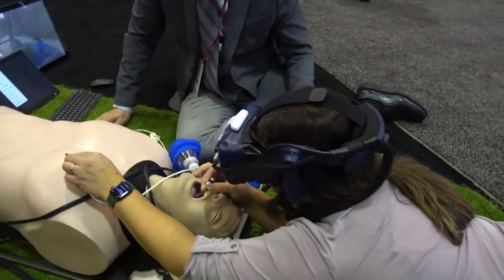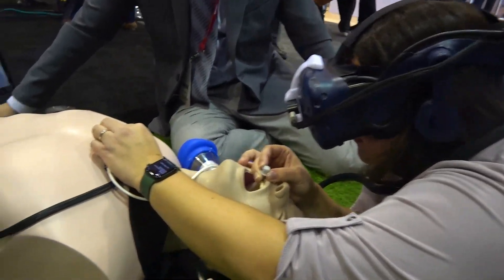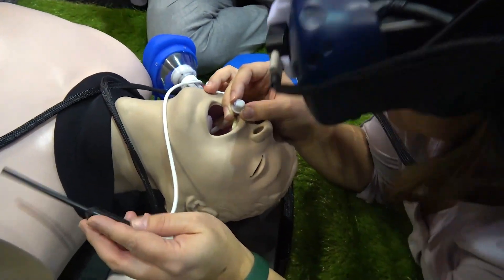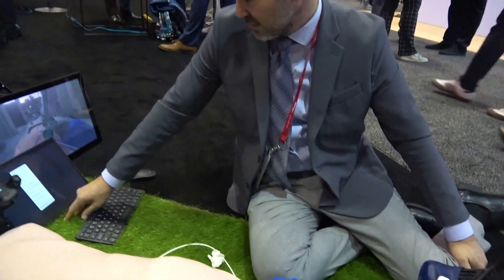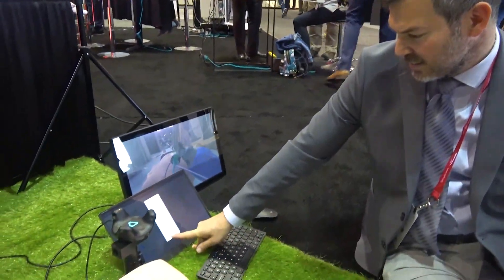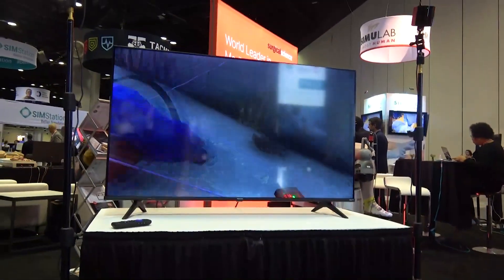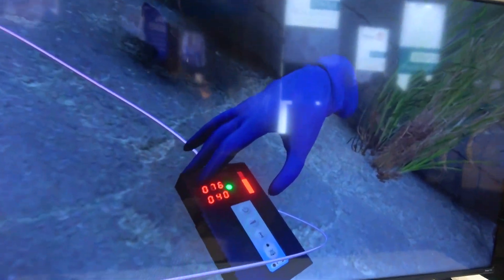My name is Guy Benisti from Surgical Science, and today we will show you some of our simulators, starting with the Trauma VR — a brand new simulator we are introducing here for the first time. First responders and emergency doctors can get a hands-on trial of upper airway intubation. We have field settings and hospital settings, and they can check patient vitals and respond accordingly to any additional problems.